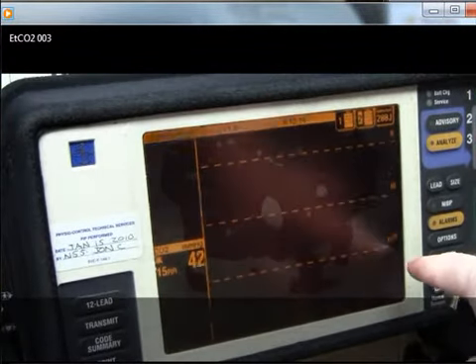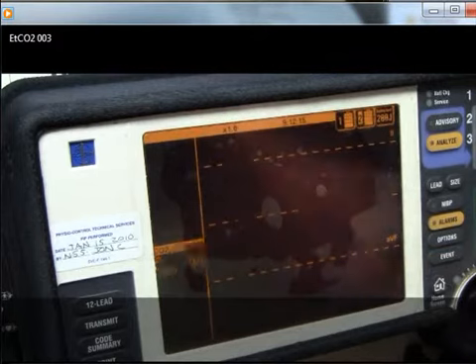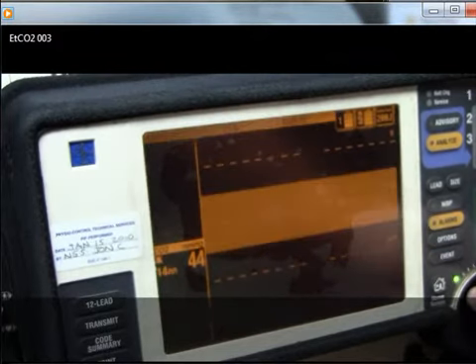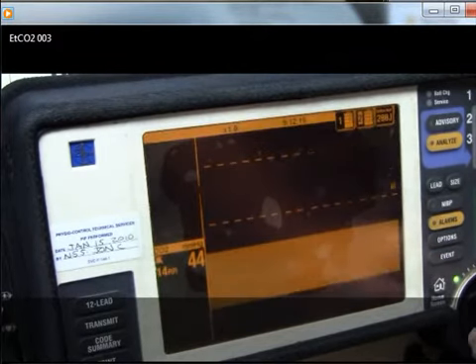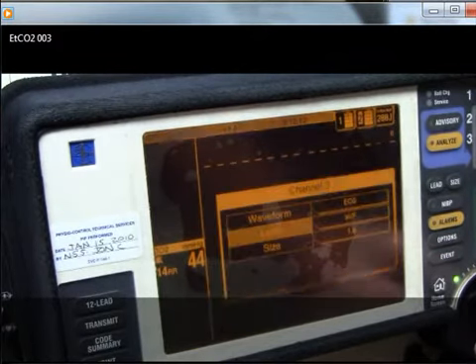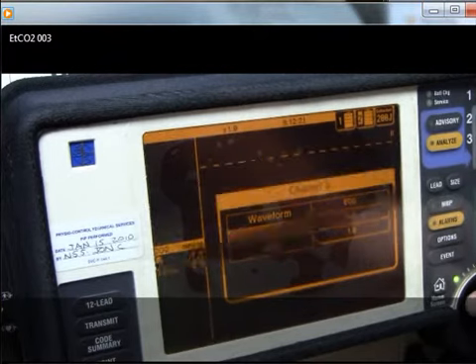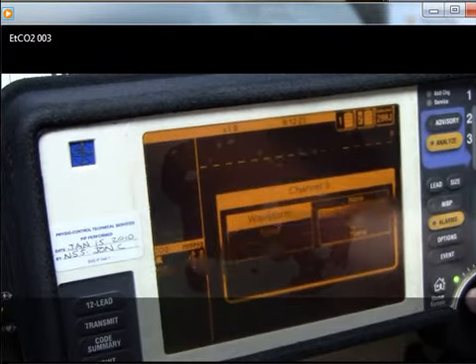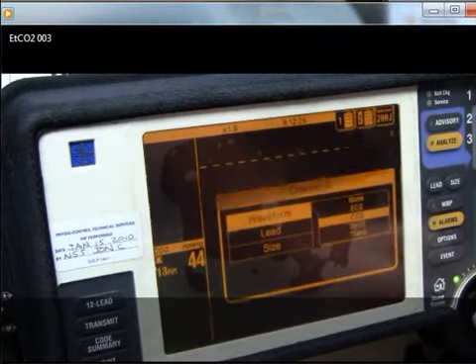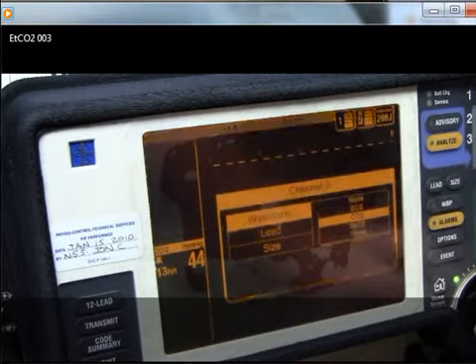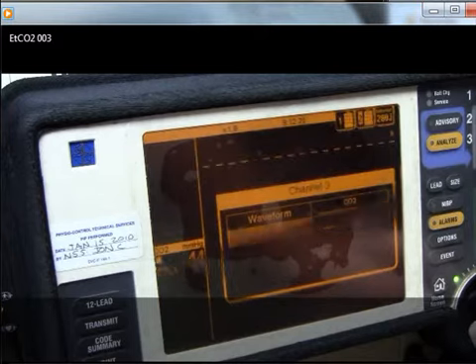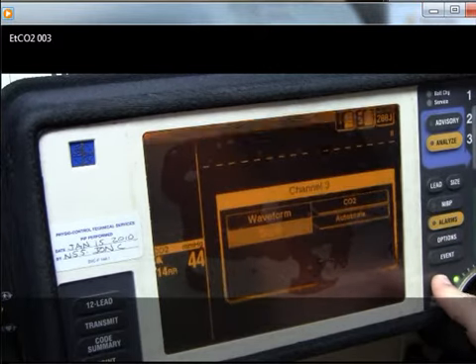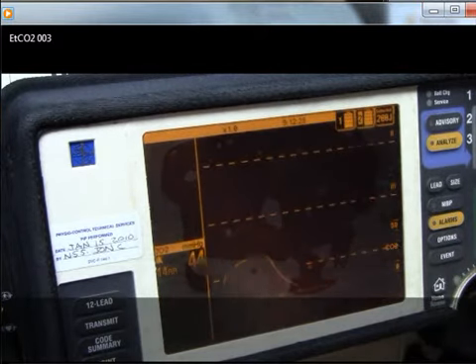This is because the waveform has not been assigned to a display channel. To do so, scroll the selector knob until either channel 2 or 3 is highlighted on the monitor screen. Push the selector knob and scroll to waveform, then scroll to the wave you want. Here, we select CO2.